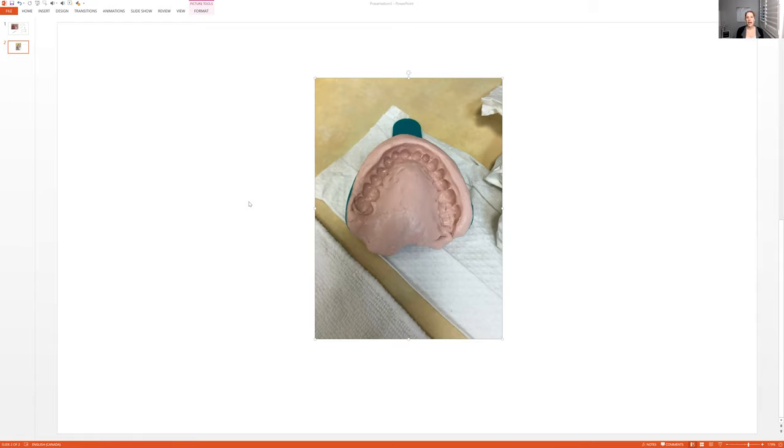But if they say I have no idea, I've never had them before, then you want to explain everything to them. So I say, okay, well, this is super easy. We take impressions of your top teeth and the bottom teeth. I will do the top teeth first.